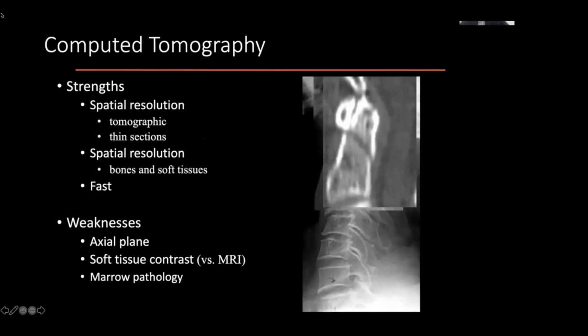And again, the good thing about CT is, again, widely available. Most of you will have a CT scanner available. If not in your emergency room, immediately adjacent to the emergency room. Similarly, if not in the OR, immediately adjacent to the OR, probably. And so this is very accessible, very quick, has very few limitations as compared to, for example, MRI.